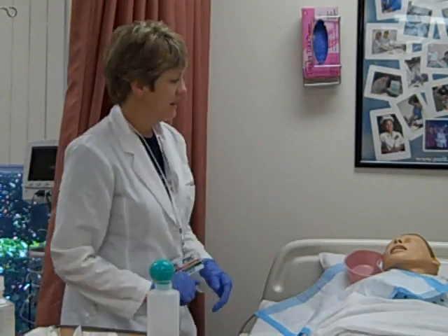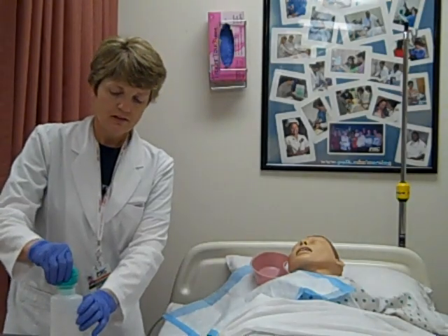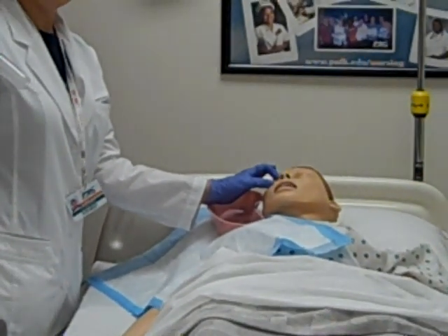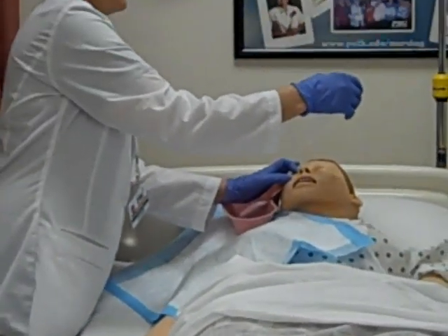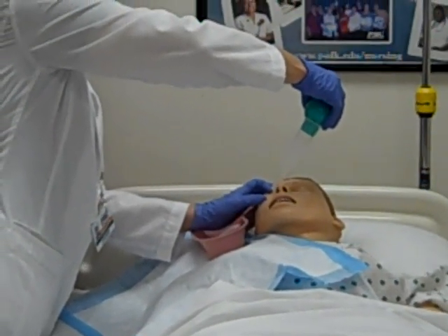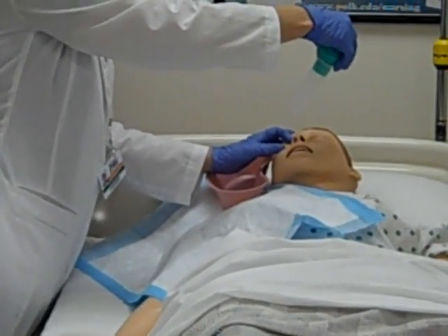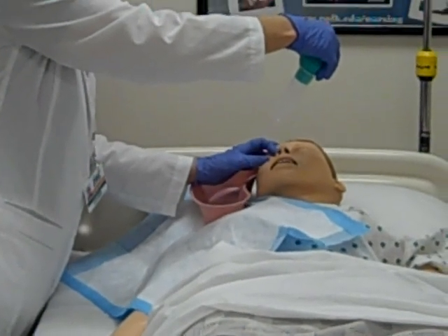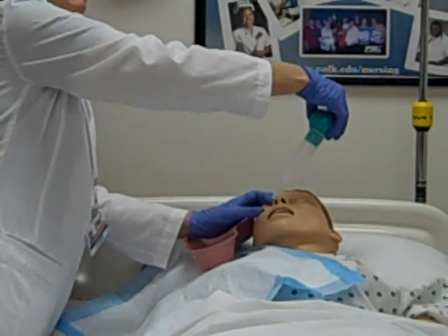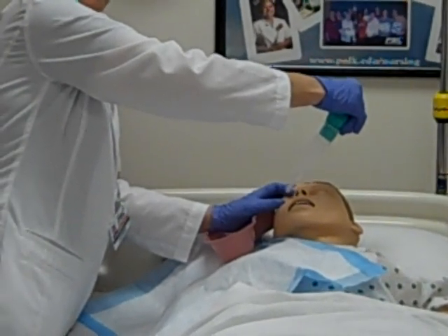So you've done your eye assessment and cleaned it, making sure you're not going to push debris that might be on the outside back into the eye when you irrigate. I'm going to fill my bulb syringe. I'm going to gently take my fingers and hold the upper lid and the lower lid apart. I'm going to hold the syringe about half an inch above what we call the lower conjunctival sac, pulling the lower lid down and aiming it down into that lower conjunctival sac. I'm not going to aim it directly on the anterior portion of the eyeball, but down into that lower conjunctival sac. The tip of the syringe is aimed from inner to outer, so I'm going to go ahead and instill my solution, aiming it at the lower conjunctival sac, inner to outer canthus.